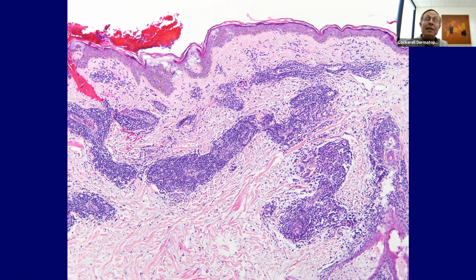If you see nothing, you think of the gyrate erythemas, of which there are about 4 or 5 that can all give you that pattern. I wouldn't put sarcoid in there though, somebody mentioned that, but I would put indeterminate Hansen's disease in there because that can give you a perineural and perivascular infiltrate of lymphocytes with only a few histiocytes in the early stage of that.